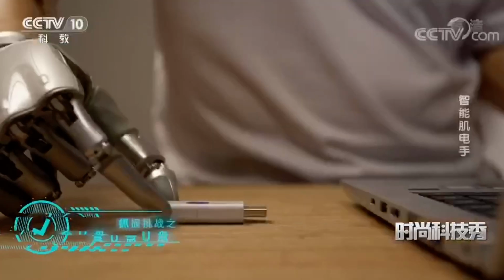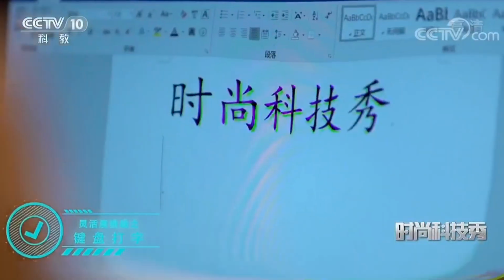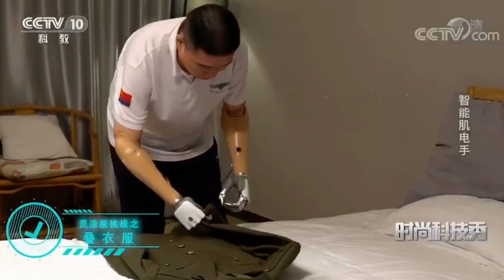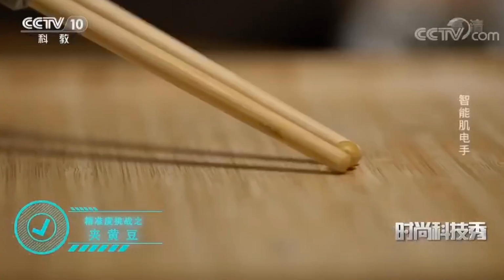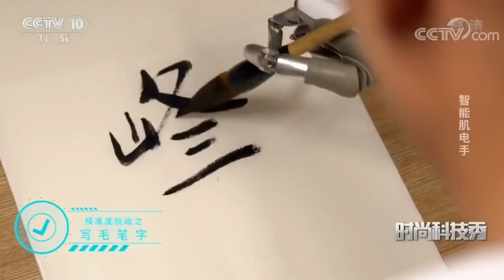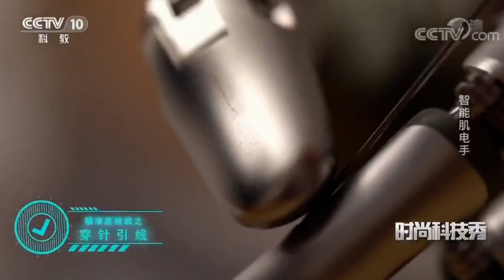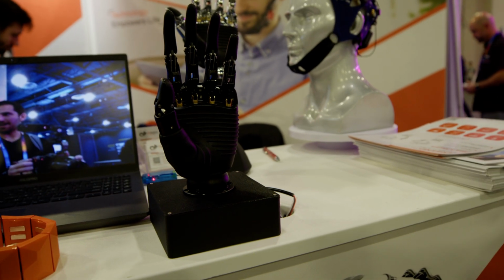But obviously, the robotic hand can be controlled through anything, right? Like the keyboard. So we originally started with EMG. Those are armbands, and that's how we went into prosthetics. It's a control system for amputees, right? But for robotic hands, when it comes to manufacturing, they will need more delicate things like that. They might want a more intricate hand, or let's say a rescue robot, in a hazardous area. Yeah, exactly, something like that.